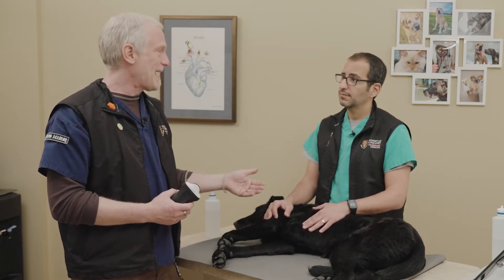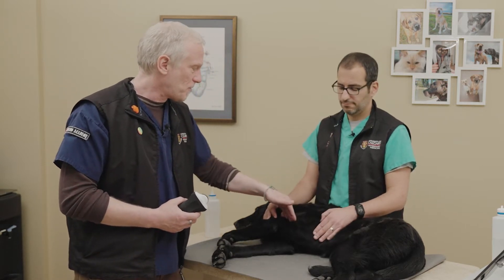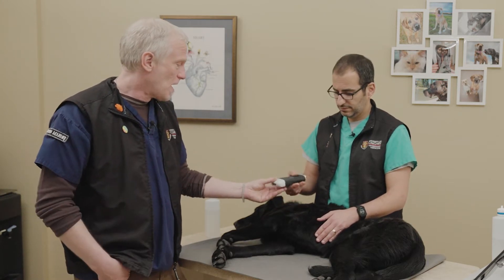There are lots of different protocols out there. We like the sliding S-shaped protocol, scanning the dorsal third, the middle third, and the ventral third of the lung. We slide cranially, come down ventral, slide the middle, come down ventral, then slide the ventral area of the lung. Serge will demonstrate this S-shaped pattern starting at the most caudal dorsal site, which we've already discussed when we talked about pneumothorax.